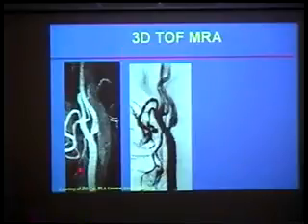There is a fundamental flaw of this type of imaging, regardless of whether it is done by MR or by the so-called gold standard, in this case this DSA image. This really measures the lesion indirectly. This only measures the effect of the atherosclerosis that is actually growing in the wall, not in the lumen itself. But this simply tells you that this part is likely to have lesions. It does not really tell you whether lesions grow at other areas, and also it does not tell you what is really in this lesion.